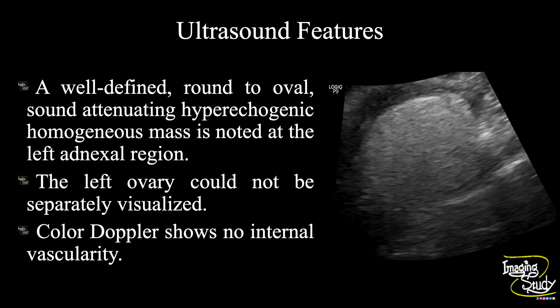In summary, a well-defined round to oval sound-attenuating hyperechoic homogeneous mass is noted at the left adnexal region. The left ovary could not be separately visualized. Color Doppler shows no internal vascularity. The features suggest it as a dermoid cyst or cystic teratoma.